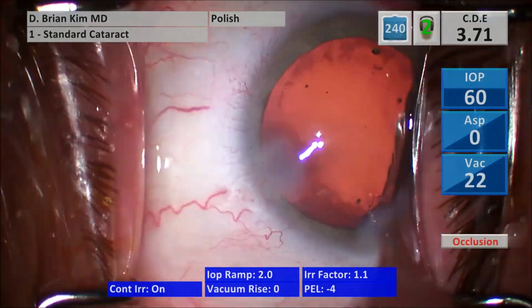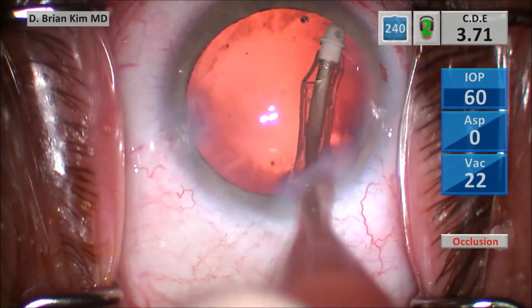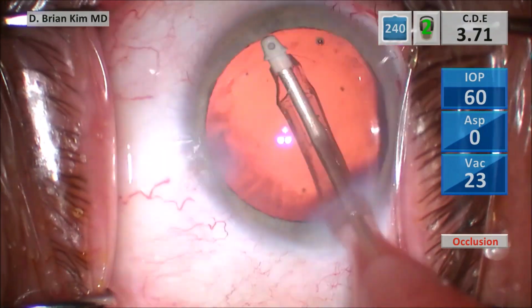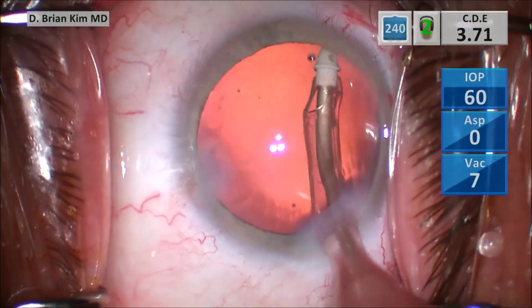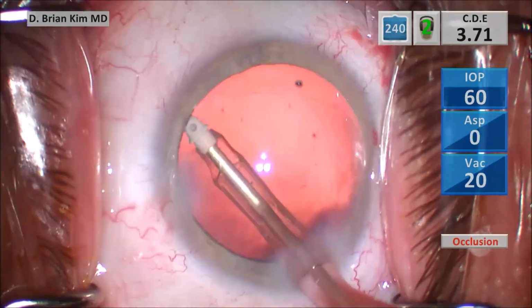Whenever it comes out like that in an uncontrolled way, I've noticed there's a lot more cortical wispy material, but that's okay. I'm using polish mode to very carefully and gently remove that material, and then also polishing underneath the rexis edge of the lens epithelial cells.